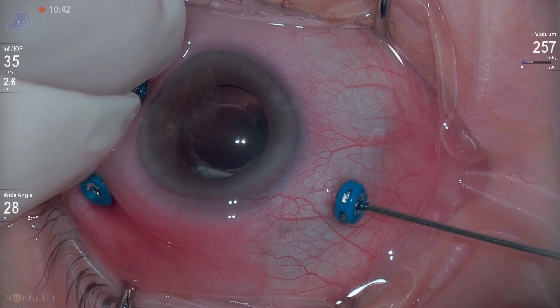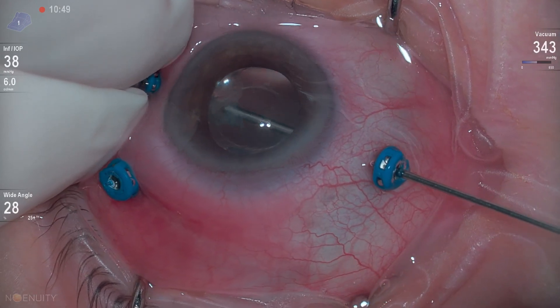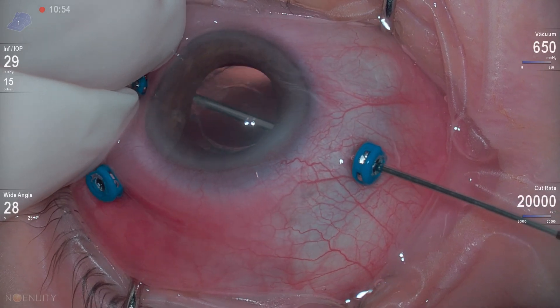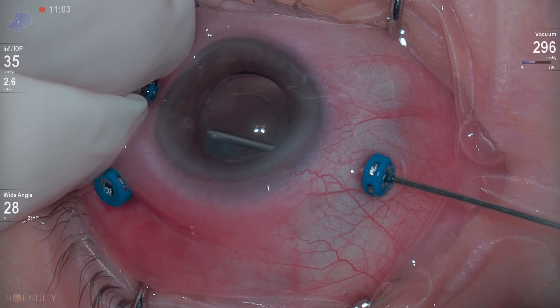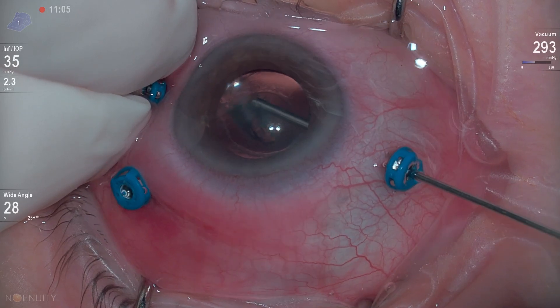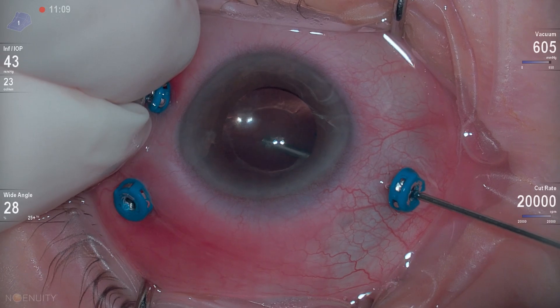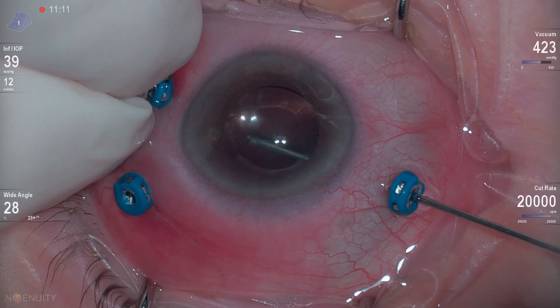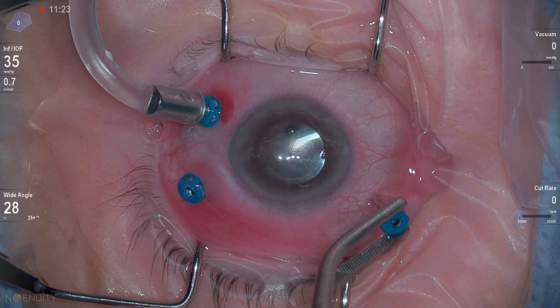We'll go back to the anterior segment, and this is really important — clean up your anterior segment. You want to remove all of that cortical material that can become a Soemmering's ring or cause inflammation. Go after it. Get it out from behind the IOL. Sometimes it'll be even in front of the IOL, and you'll need to go up and around or into the anterior segment to remove that cortical material. But you can see we've got it nicely cleaned up.